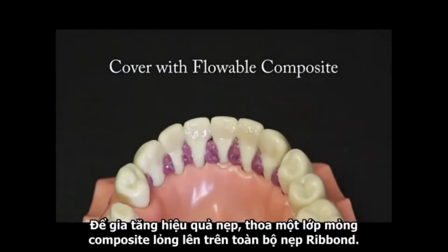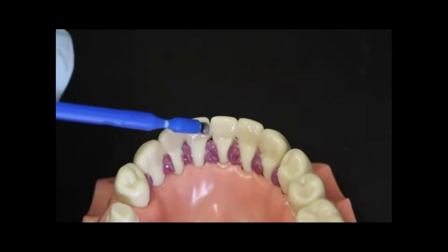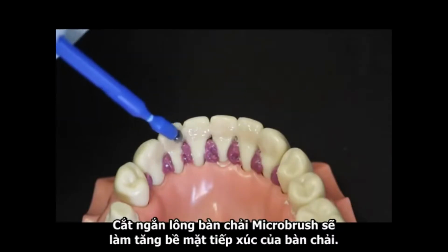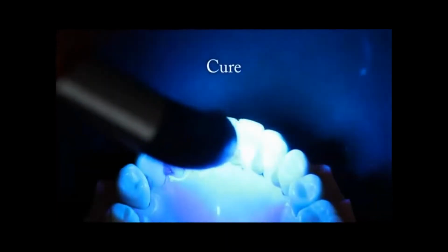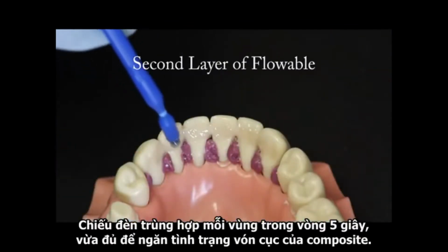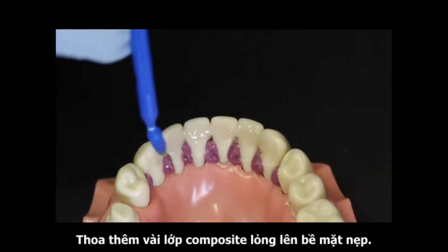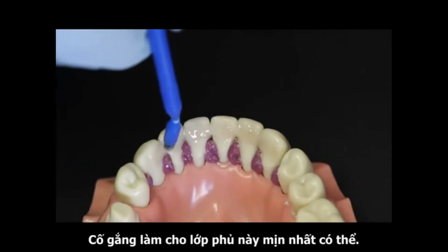For an extra coronal splint, paint a thin layer of flowable composite over the ribbon splint. Shortening the bristles of a microbrush will add more body to the brush. Do not use the ribbon securing composite for this layer. Polymerize each area for 5 seconds, just enough to prevent the composite from slumping. Paint another couple layers of flowable composite onto the splint. Try to make this covering layer as smooth as possible.